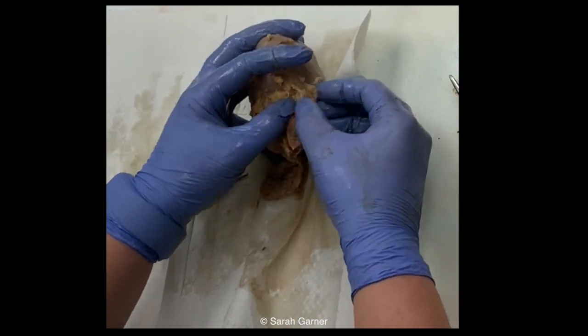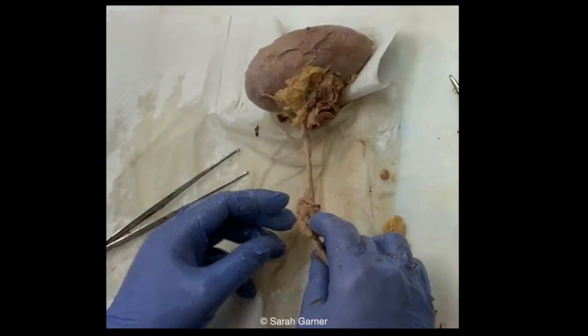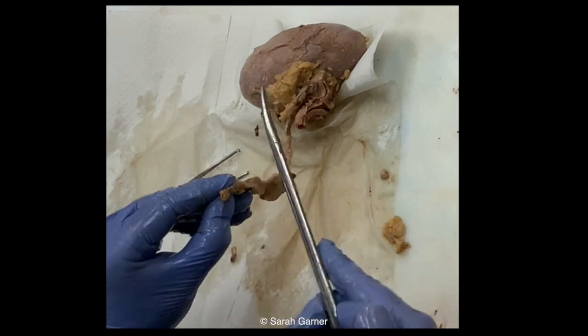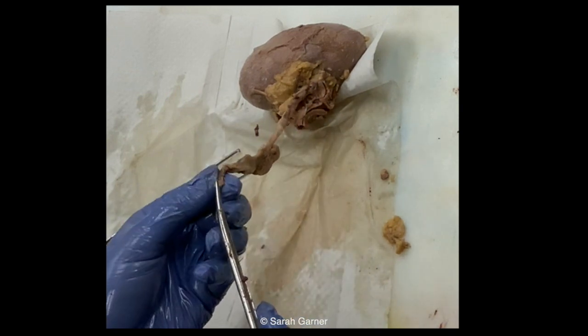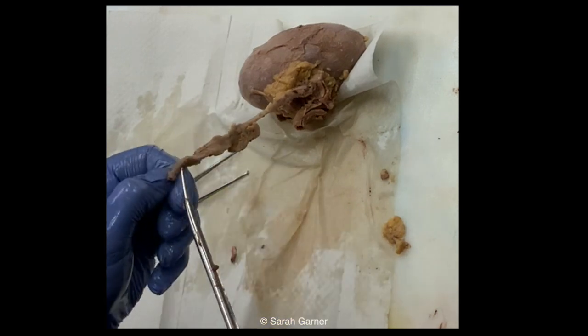So I opened it up here. I don't really see anything abnormal in here either. And then lastly, we'll go ahead and open up our ureter. Typically the lumen of the ureter is going to be a lot smaller than the vessels. So you may need to stick a small probe in there. You may need to get some little scissors. You may not be able to get in there with these big ones.